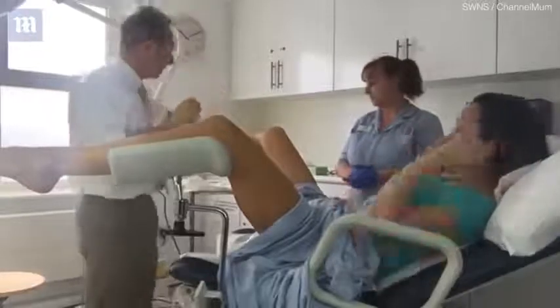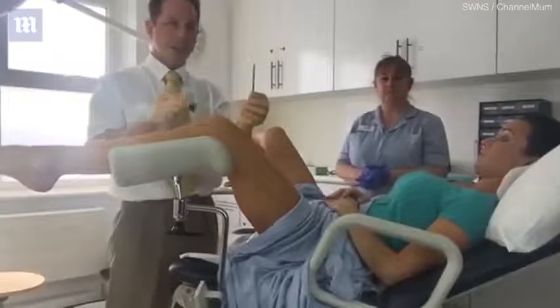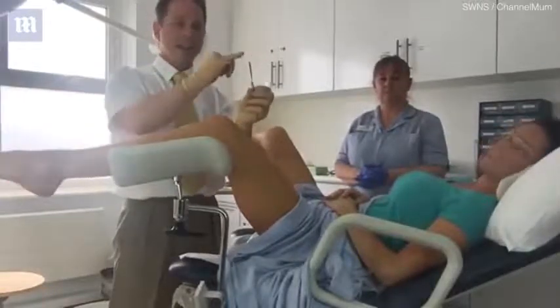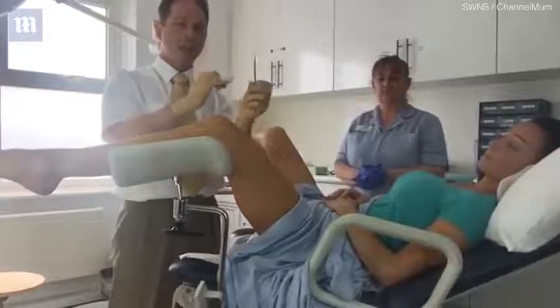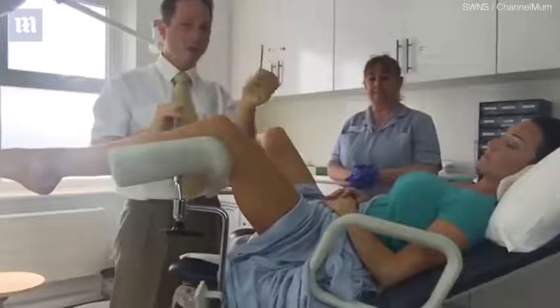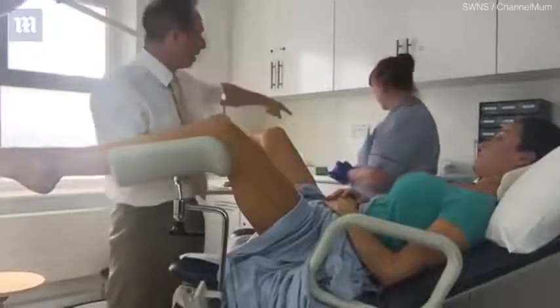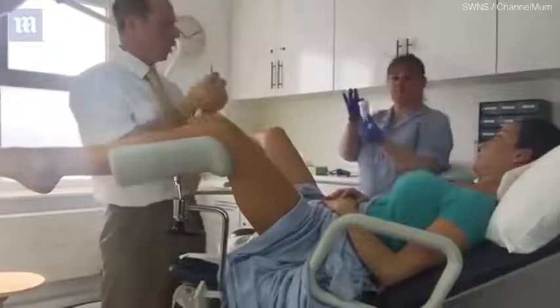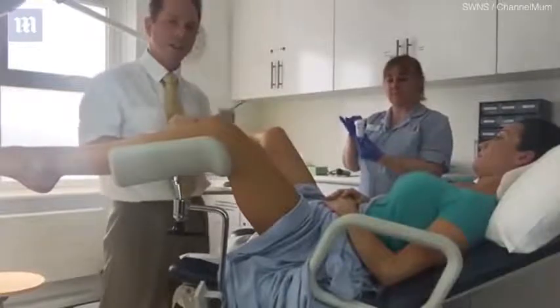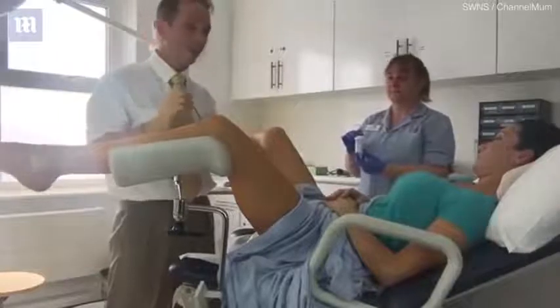Once we've got the cervix in view, we have what's called a cyto brush, and this is a little brush with fine little hairs at the end. It's very soft, it's non-painful, and effectively it rotates around so that we can scrape some of the cells off of the cervix to go off to analysis. Once we've done that, Marlene will show you, they get washed off and go into that little pot there, and then they go through clever preparations so that they can be inspected by cyto screens, who are the people that look at the abnormal cells.